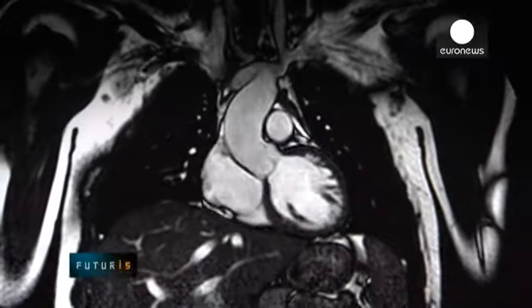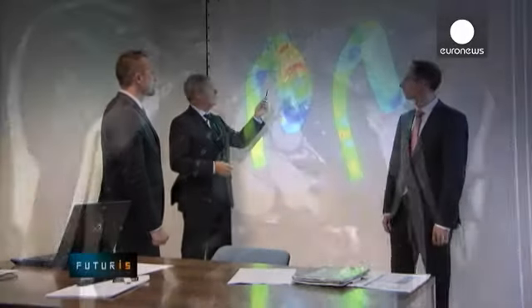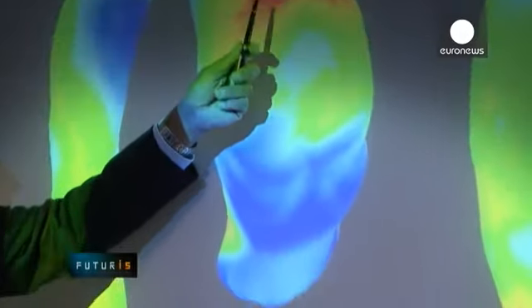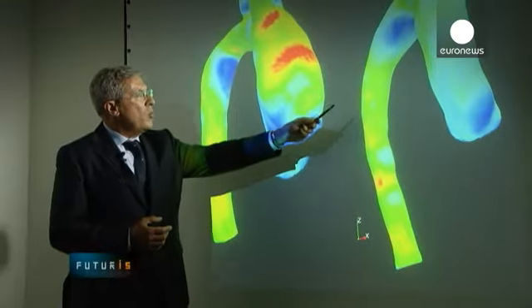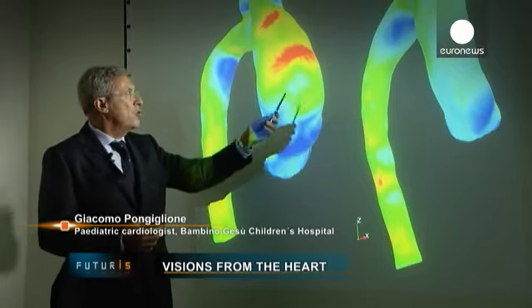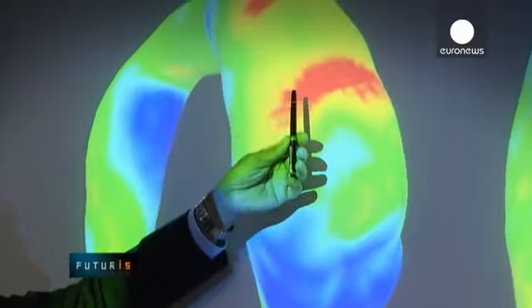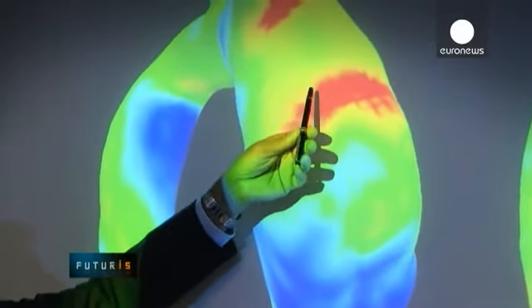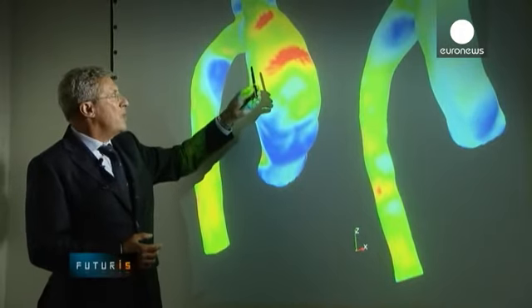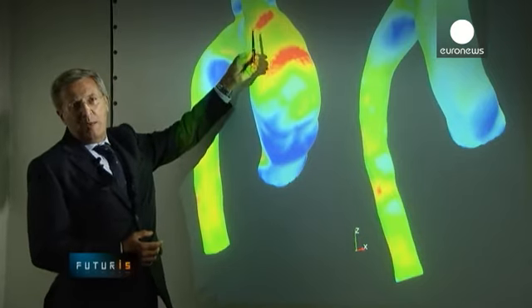And this personalised data translates into useful information for paediatric cardiologists on the best way to help both Giordano and thousands of other young patients. Compared to a healthy subject where no particular region of the aorta is under pressure, in this other study case we've been able to identify 2 risky regions. They're here in red. And there are 2 because due to its particular flow, this blood is first hammering this region of the aorta wall and then it bounces back to hit a second region.